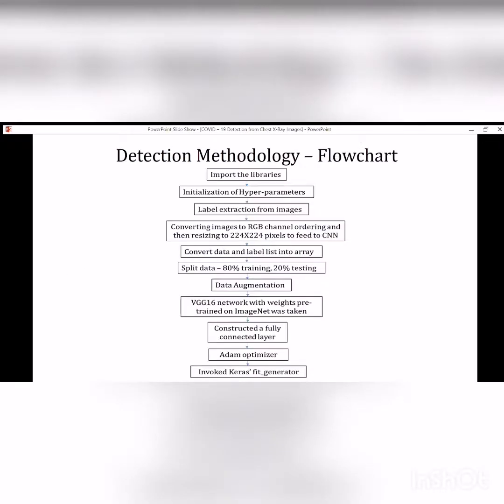We have looked to fine-tune a convolutional neural network model using TensorFlow 2.0 and Keras deep learning libraries, using tensorflow.keras, to automatically detect whether or not the person whose chest X-ray is in consideration is affected with coronavirus. For loading and preprocessing the images, scikit-learn, matplotlib, OpenCV, NumPy, and many others were considered. We initialized the hyperparameters, namely the initial learning rate, which was set at 0.001, number of training epochs set to 25, and the batch size as 8.